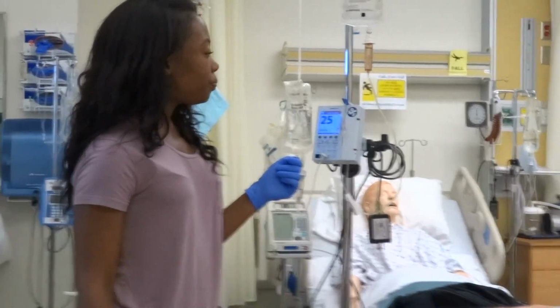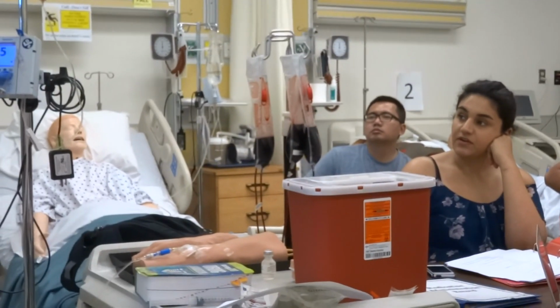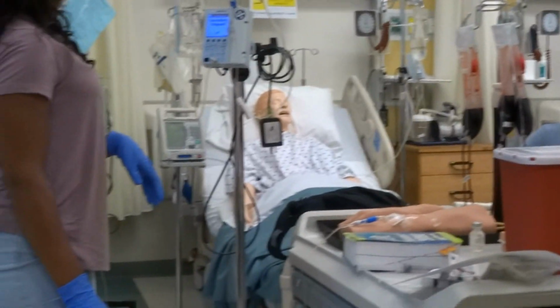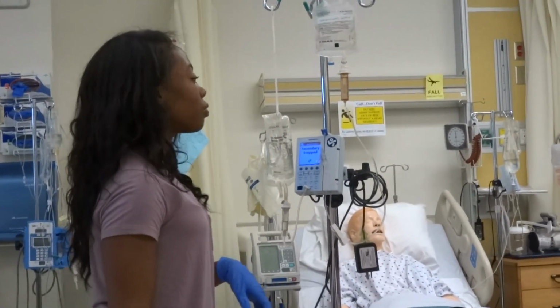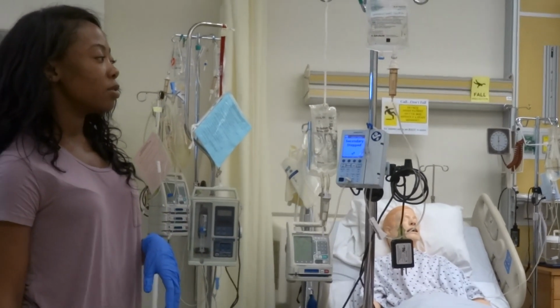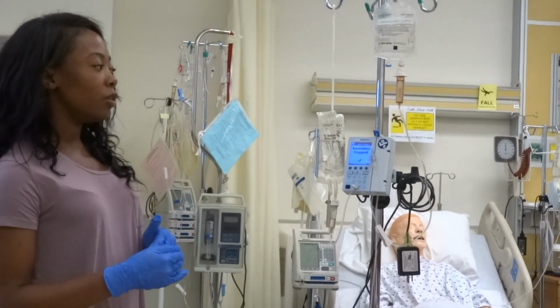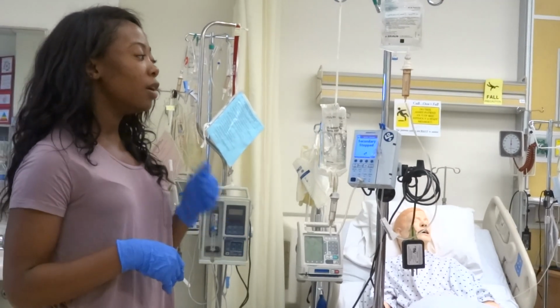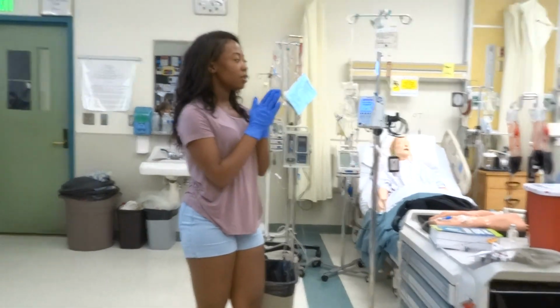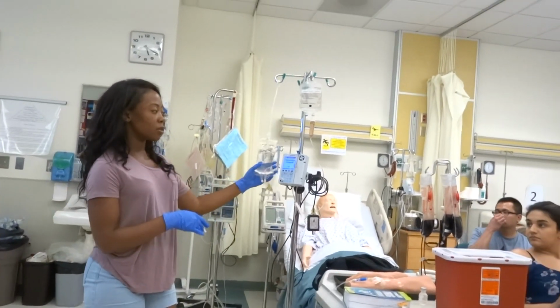So is the secondary going to come with an order of a specific rate? Yeah. The rate is going to be prescribed. You're not changing the rate, like I say. You can change the volume to be infused, because you don't want your machine to ring you back. You want the patient to get all the medication. You literally want it to look like it's flattened, and then you want this one to run next.